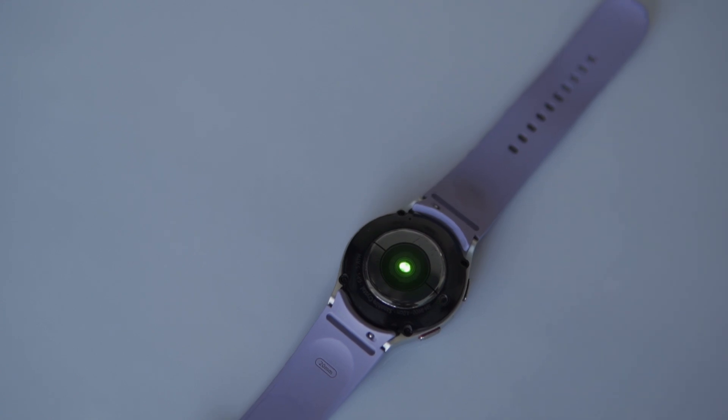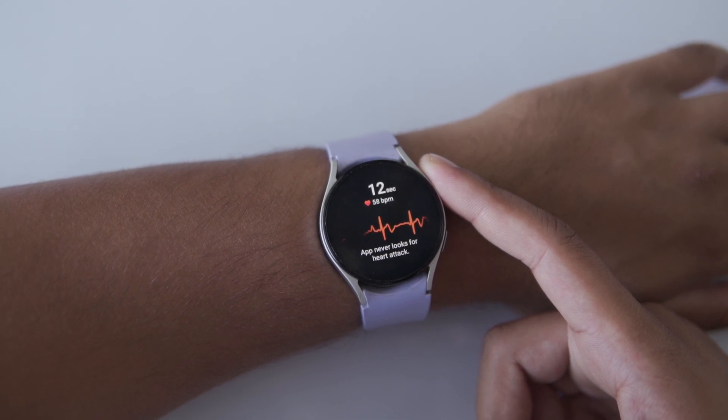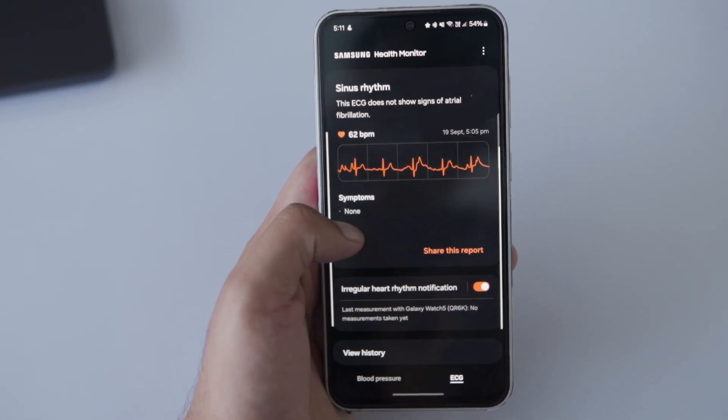So, what exactly is the ECG? The Samsung Health Monitor app uses the watch to record your heart's rhythm, checking for irregularities like atrial fibrillation. It tracks your heart rate and ensures everything is in sync. Plus, you can save, view and share your ECG reports right from the app on your phone.